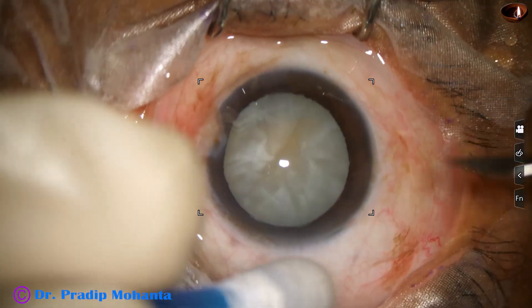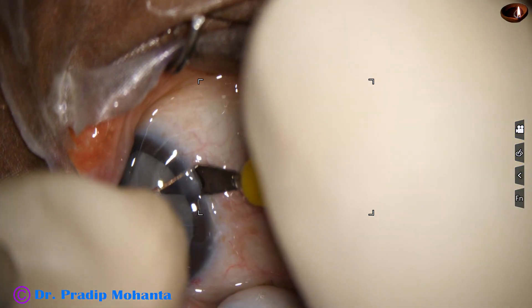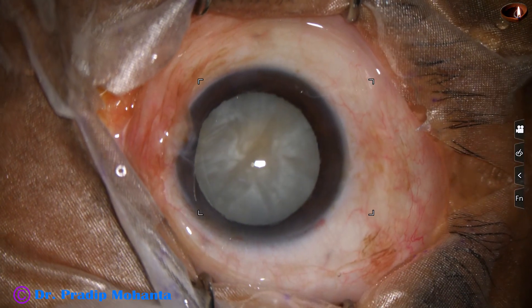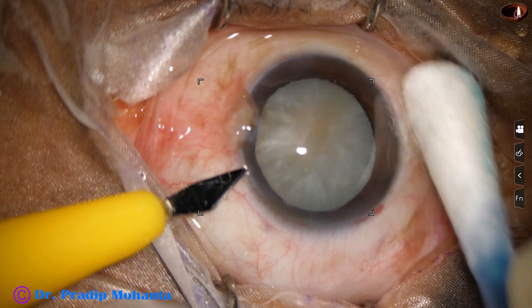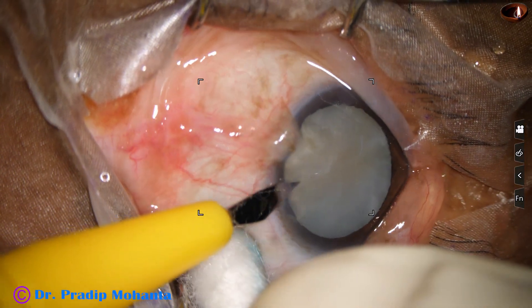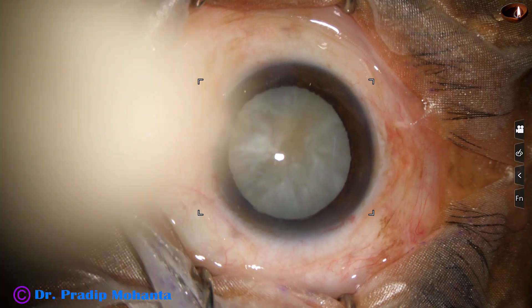This is an intumescent cataract after making the main incision. This is a side port on the right side of the main incision and this is another side port on the left side. The side ports are about 3 o'clock hours away from the main incision.